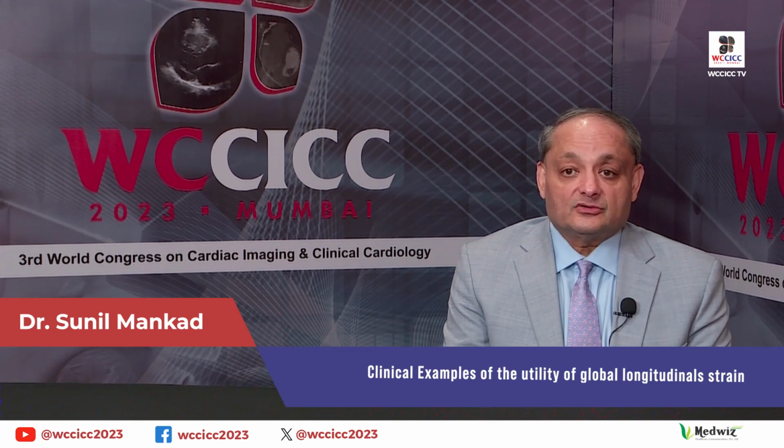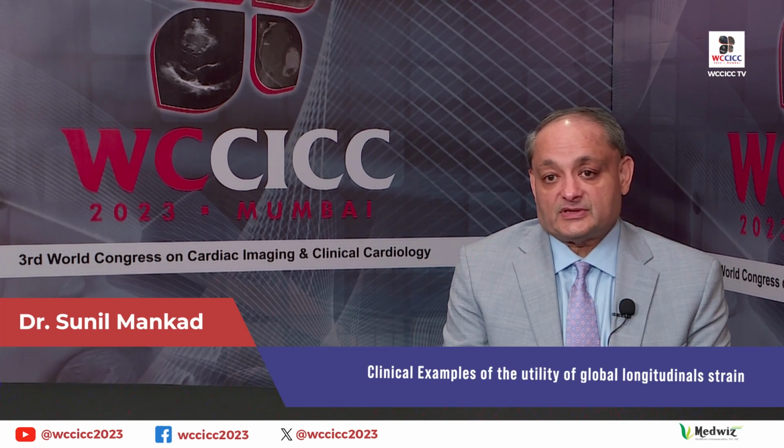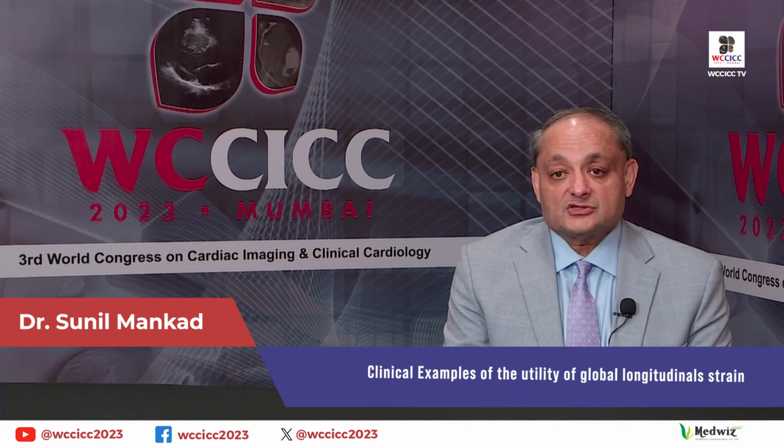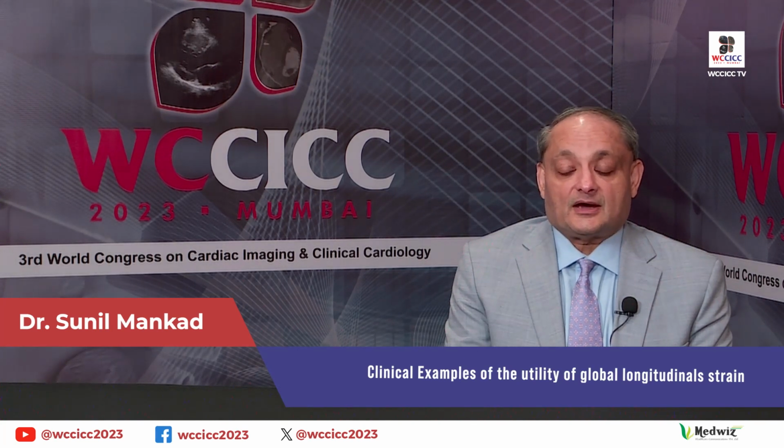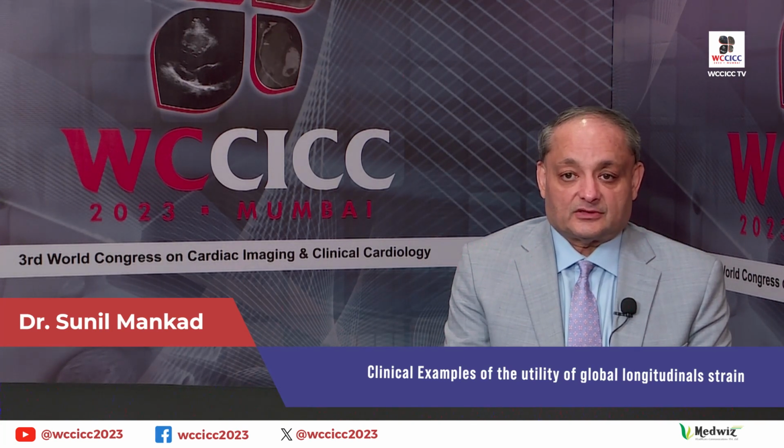Finally, to detect early subclinical LV dysfunction in patients with valvular heart disease can also be important. In asymptomatic aortic stenosis, strain imaging has been demonstrated to really prognosticate how survival occurs.